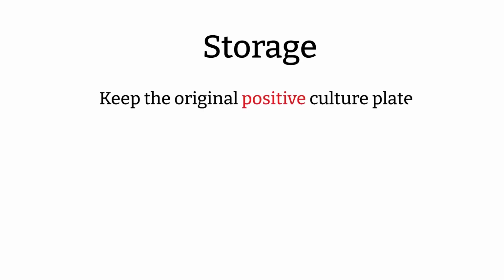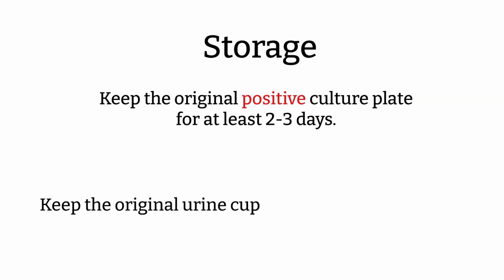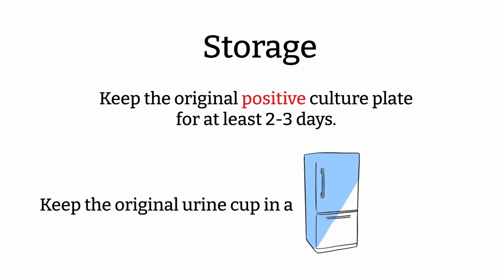Specimen storage. Other than incubating the subculture plate, we would hold the positive plates for 2 to 3 days at room temperature for further workup if requested by the physicians. In a high-volume hospital, holding onto urine cups in the refrigerator for 24 hours may not be possible because of space limitations. Instead, we could transfer urines into a gray top tube with preservative to prevent overgrowth.